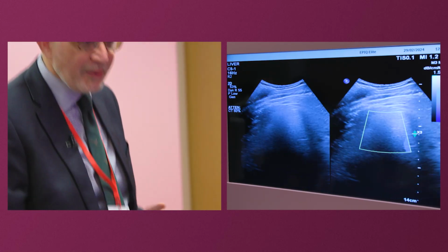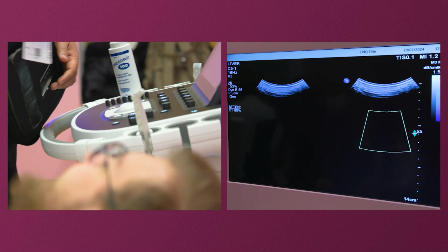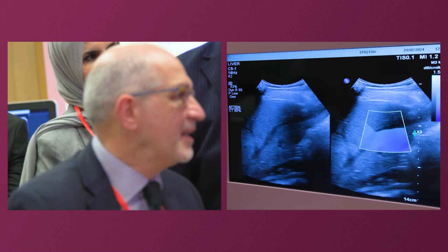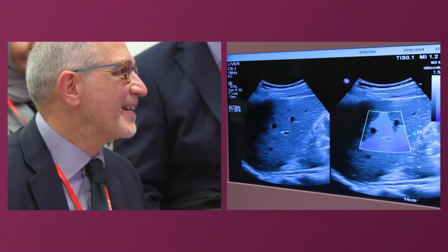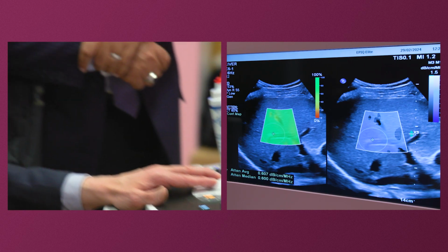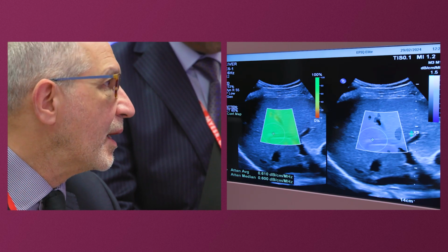Bring it down. No, don't get him to breathe. I'll tell you how it comes up. I don't know where the things are, but I can show you. I'll show you where to do this. Because if you breathe, you increase pressure in the, like a clock. Yeah, that's right. So you choose the area where your confidence map is best, and you want to avoid the vessel. Right? You should be able to just alter the circle diameter as well.